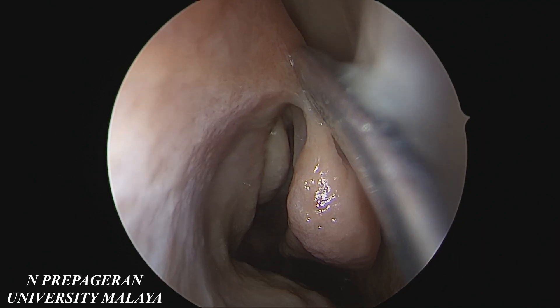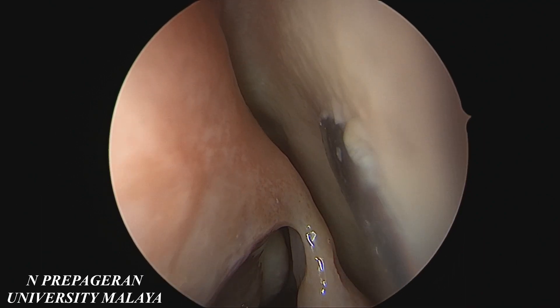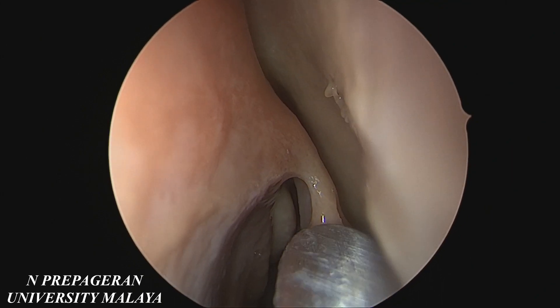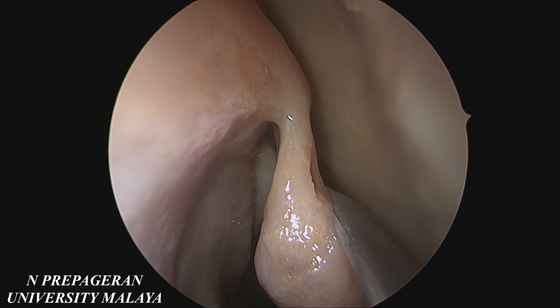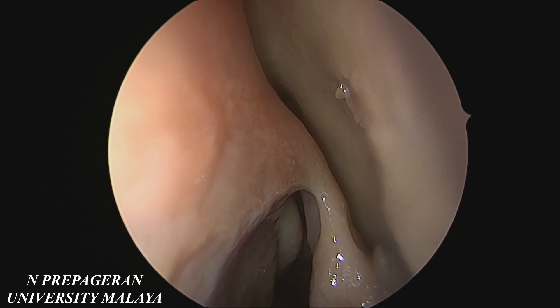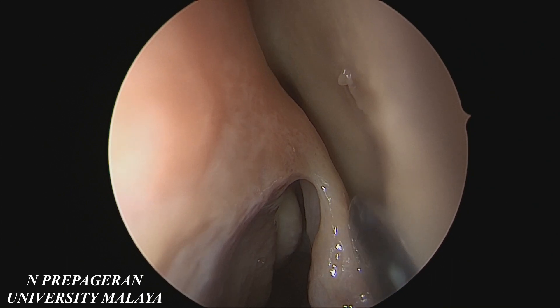This is where the middle turbinate is attached to the lateral wall. You can see the olfactory groove. Can you see the yellow discoloration at the top? That comes almost to the middle of the septum and also usually to the middle of the middle turbinate as well. So this forms the olfactory area, cleft, that you want to preserve as much as possible so you do not have any problems.